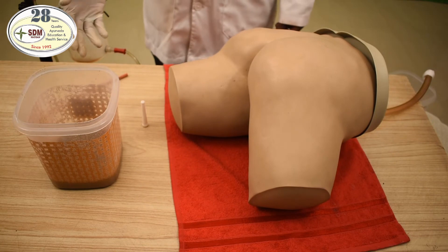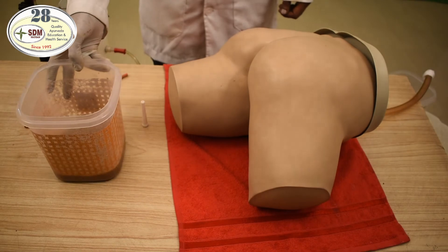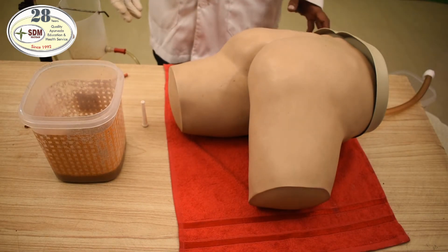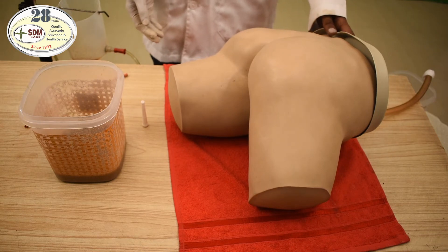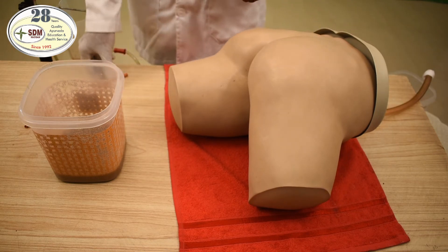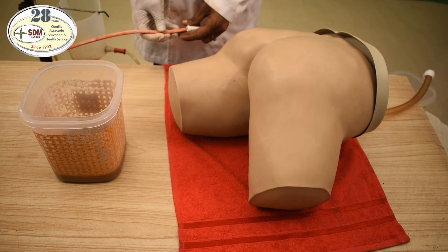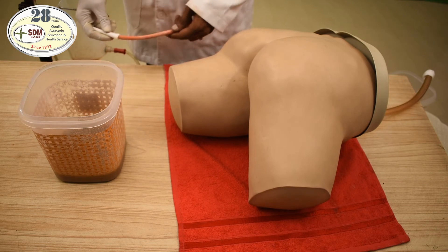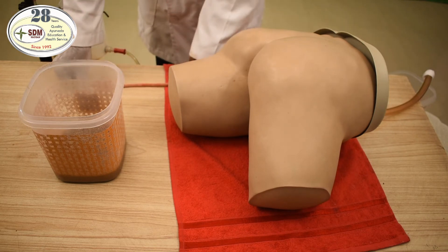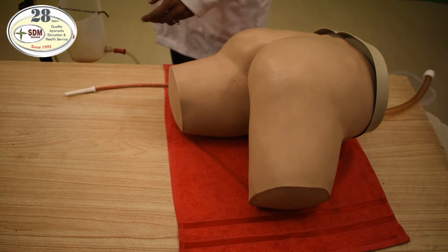Now we are having the prepared basti dravya here, as you can see. We will see how the administration of basti dravya works through this simulator. For that, you have to get a catheter pipe and an attaching pipe, which you have to fix very properly to avoid leakages. Now, you have to pour the basti dravya into the enema can.